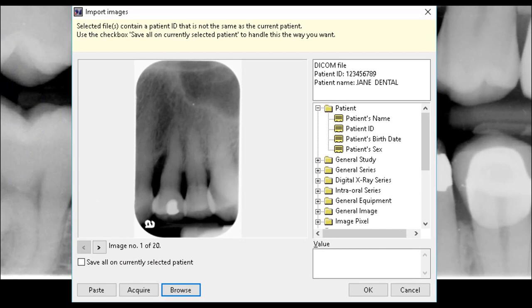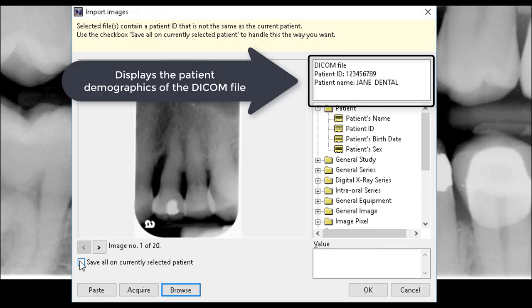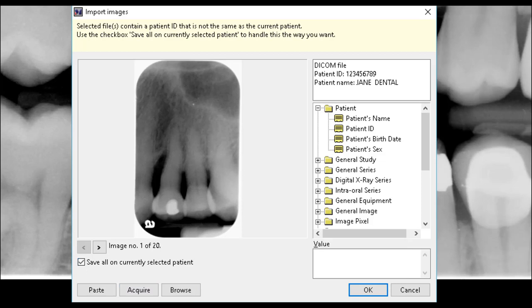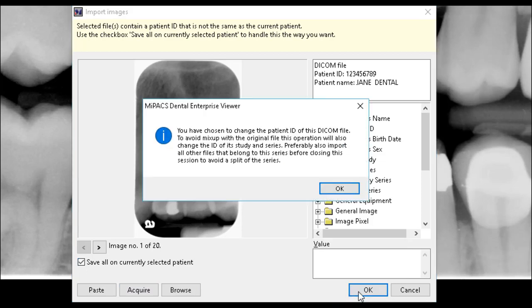The Import dialog will now display the patient demographics of the DICOM files in the upper right-hand corner of the screen. To update the patient information for the imported DICOM files, select the Save All on Currently Selected Patient checkbox. This will overwrite the patient demographics with the currently selected patient. Once this box is checked, select OK.